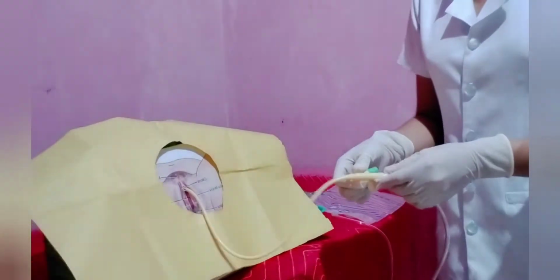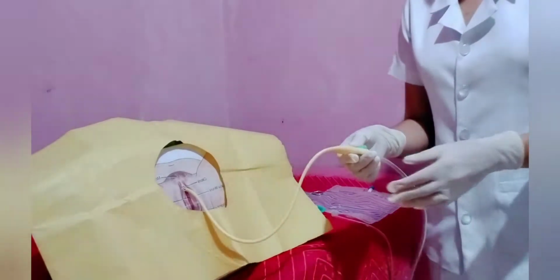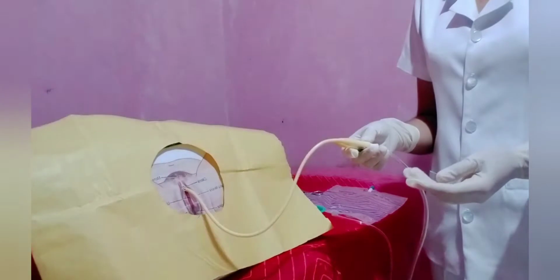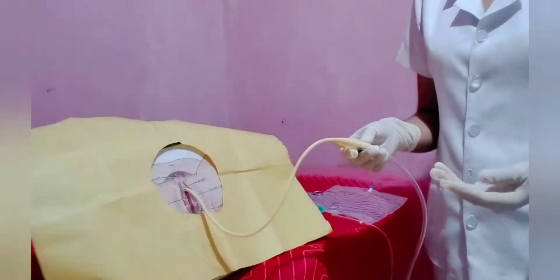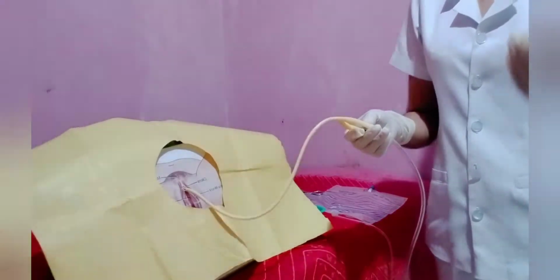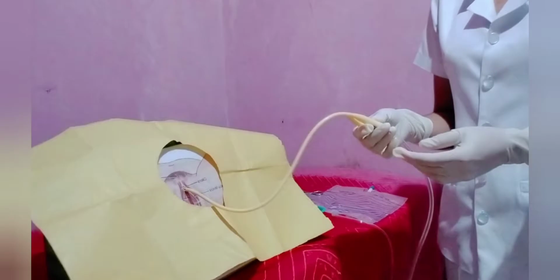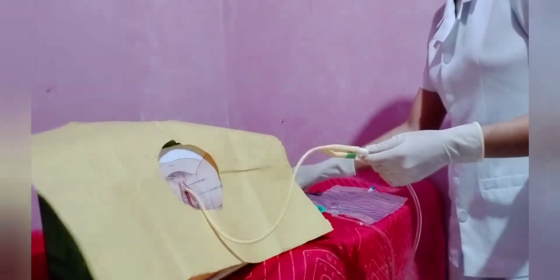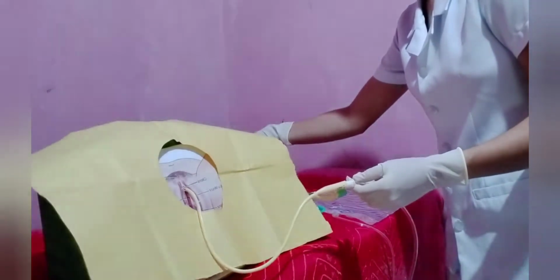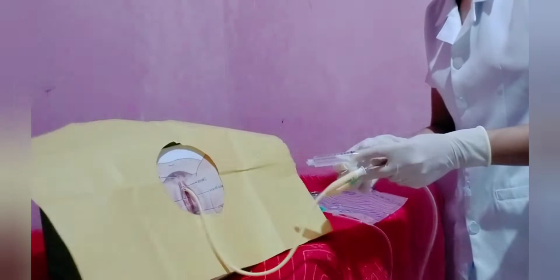And after that, inflate the balloon with 10 to 15 cc of sterile water using a 15 to 20 cc syringe, making sure that there will be no leakage of water from the balloon. This serves the purpose of anchoring it in the bladder. So we have to use a syringe. Then we have to put it inside.